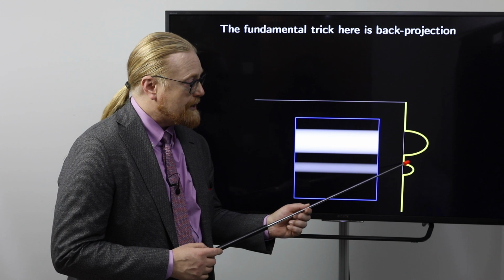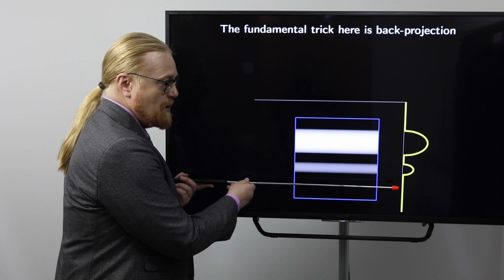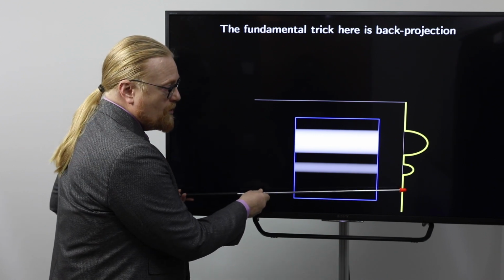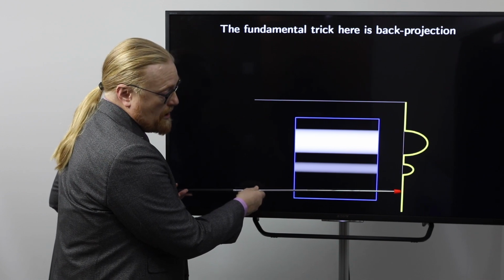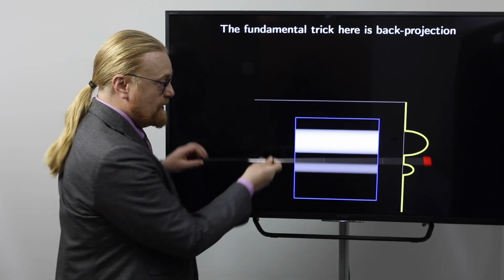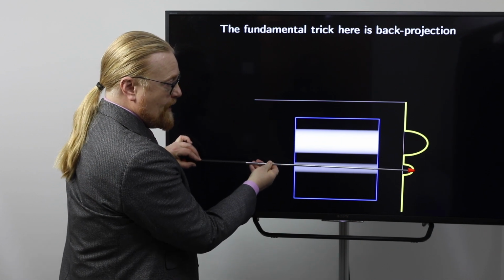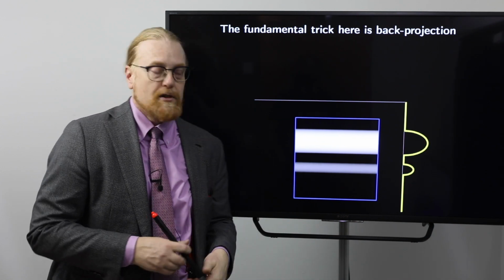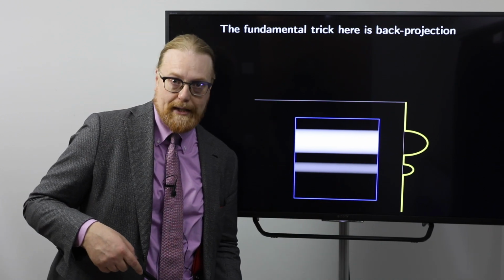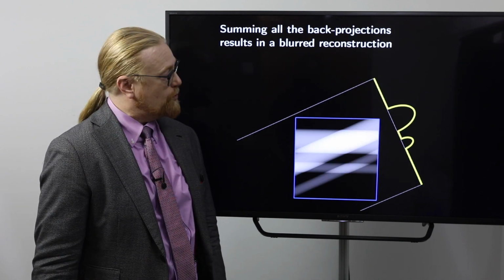So the yellow curve is our data, and we know the direction where it came from. In this case, horizontally. So for example, here we have 0. So we throw 0, which is black color, back into the image. Here, which is the largest value, it's white. So we send white back to the image, and here medium value is medium gray. So we kind of take the whole form of this one and we just throw it back along the X-rays. And then we do this along several directions. For example, these.